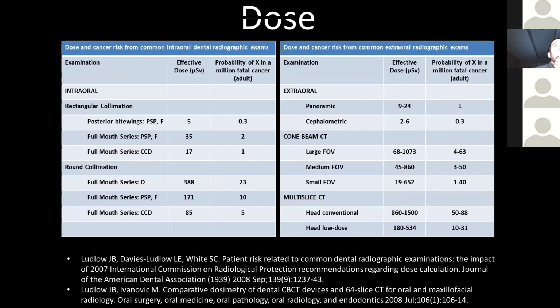So you really need to look at that ADA imaging selection criteria. And once you get your baseline, for the most part, that document outlines clinical finding-based imaging only. So if you have something new that shows up clinically for your existing patient, you take the specific images they need. That might be a pan, that might be another full mouth series, that might be just a single periapical. So it really depends on clinical judgment.